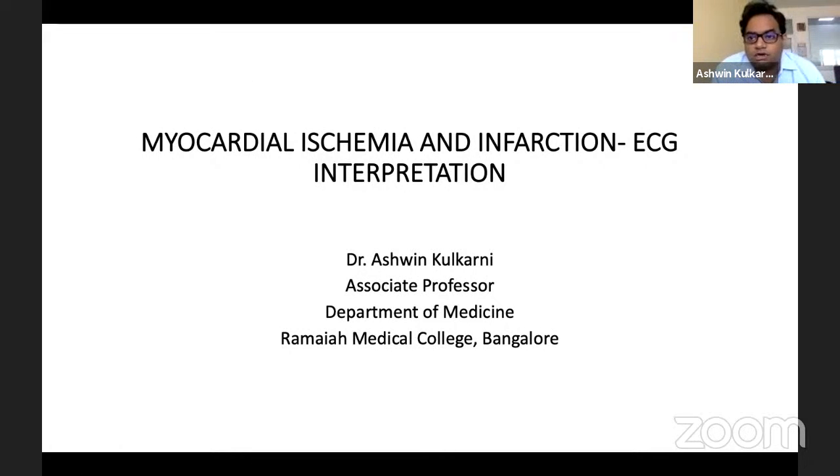So, good morning, everybody. I am Dr. Ashwin Kulkarni from the Department of General Medicine, Ramaiah Medical College in Bangalore. Today I'll be talking about ECG interpretation. The deciphering ECG module is going on, and today's topic allotted to me is myocardial ischemia and infarction, the interpretation of the ECG.